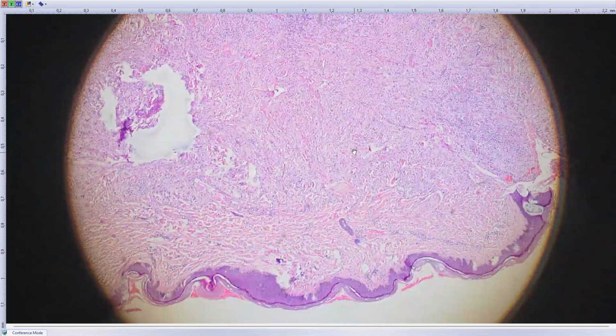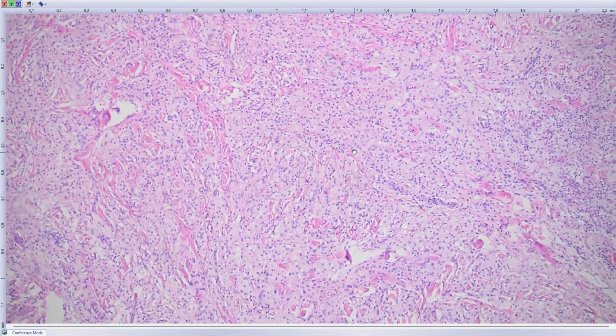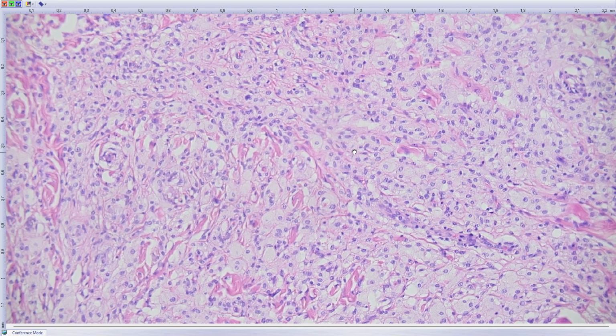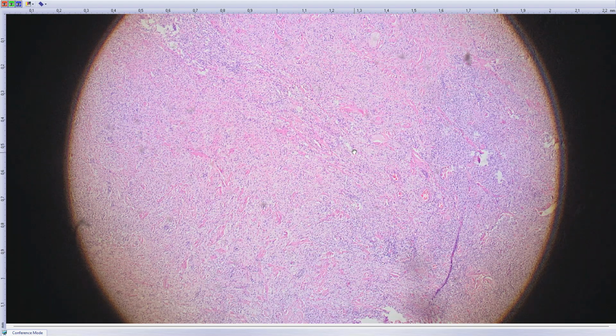So you can start thinking about some histiocytosis and this kind of stuff, but these cells are completely bland. They look more like foamy macrophages, and it's in an elderly lady, and it's close to a big joint, close to the elbow. So I think this is a tuberous xanthoma, completely benign lesion, typically found in patients with dyslipidemia.